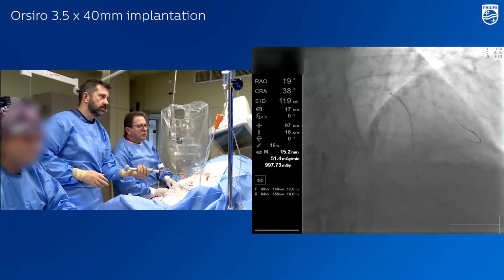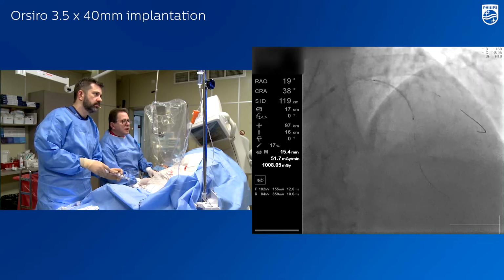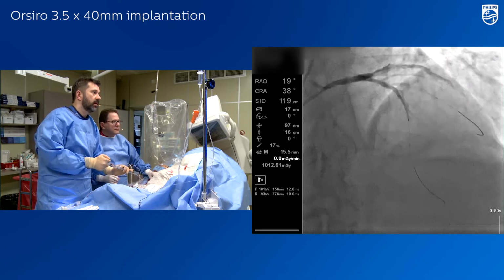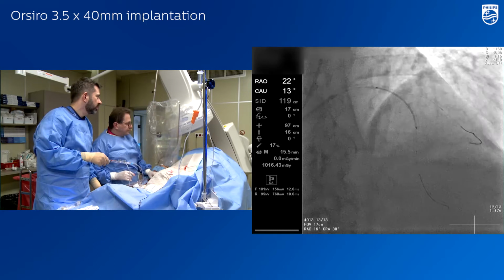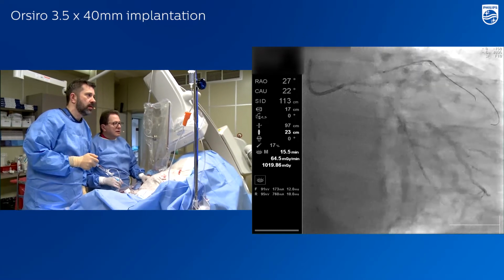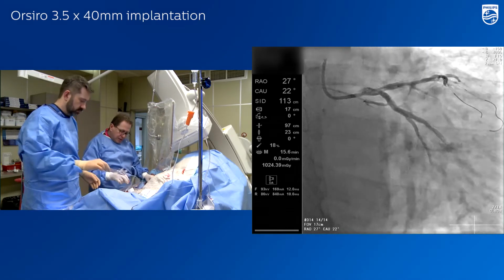As you see here, there was no problem to tackle. This is 40 millimeters length. Can you show me, because I'm a little bit too deep, of course, but not so much. This is a kind of compromise. But next we do need to check the relation to the circumflex. So we need caudal views, left and right, to see how far we are from the LAD orifice. It's okay. Beautiful. Let's register it. So you see that we are in a really healthy portion right now. I guess then we can implant the stent.